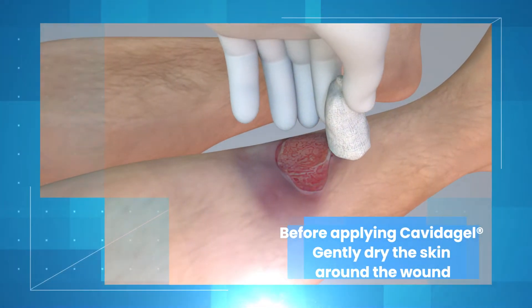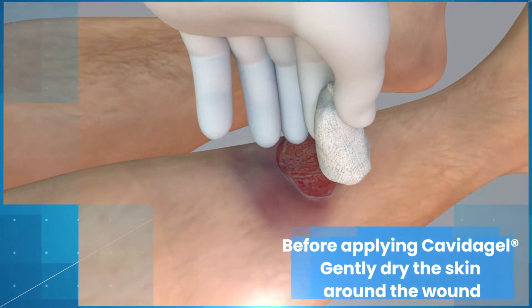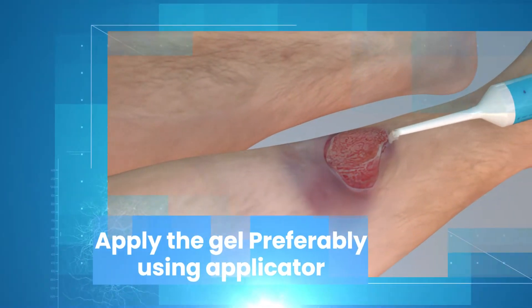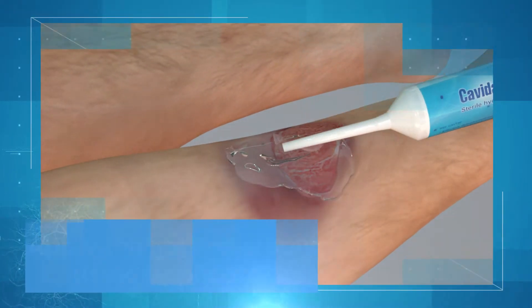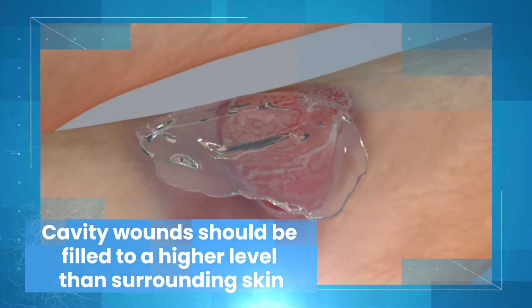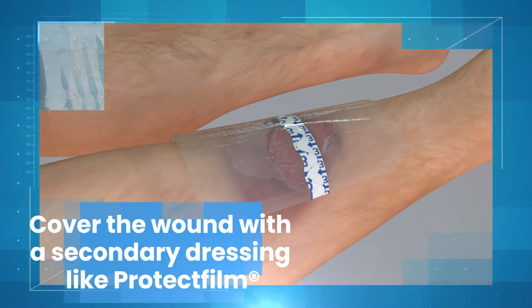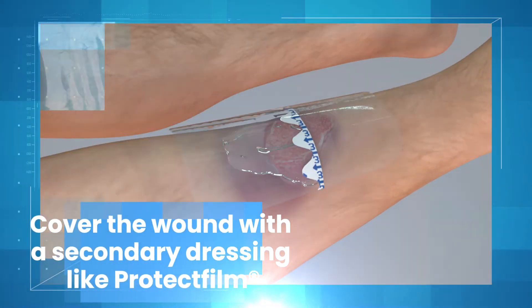Before applying Kavita Gel, gently dry the skin around the wound. Apply the gel, preferably using an applicator. Cavity wounds should be filled to a higher level than the surrounding skin. Cover the wound with a secondary dressing like a protect film.